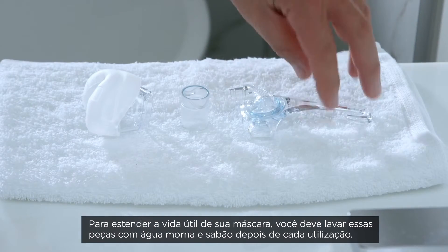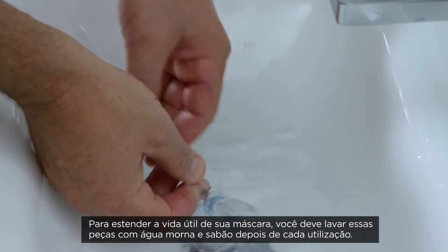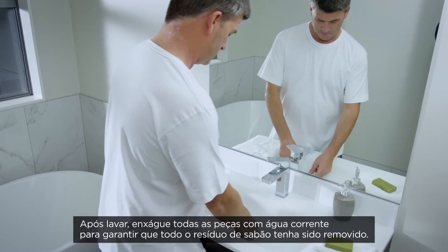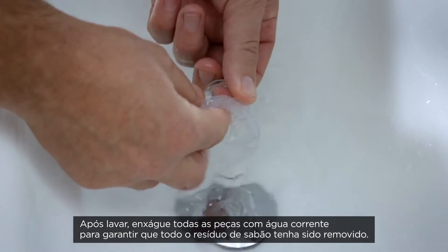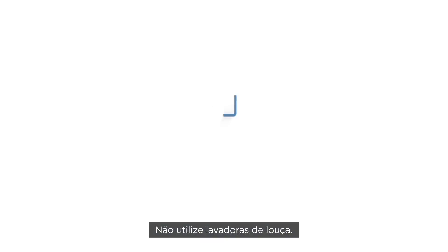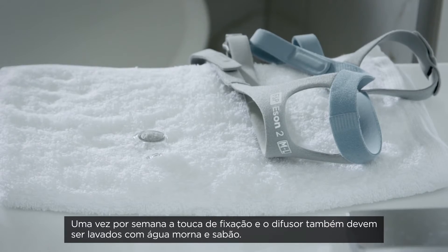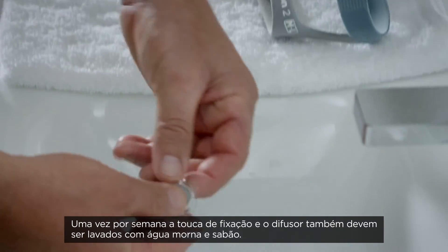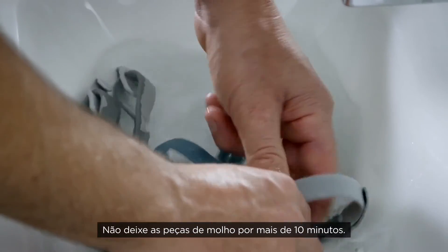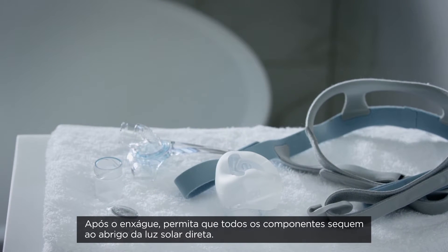To extend the life of your mask, you should wash these parts in warm, soapy water after every use. After washing, rinse all parts with fresh water to ensure all soap residue is removed. Do not clean any items in your dishwasher. Once a week, you should also wash your headgear and diffuser in warm, soapy water. Do not soak parts for longer than 10 minutes. After rinsing, all items should be allowed to dry out of direct sunlight.